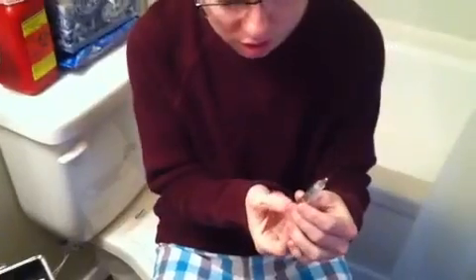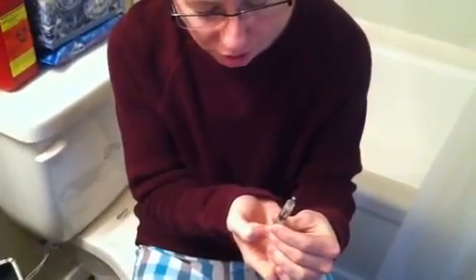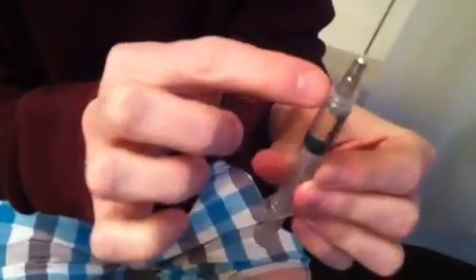So you snap it back on, twist it on, and you get that off. You want to make sure that it's on there securely. Push it all the way back up. Make sure you don't push the T out of it. Just push it enough so that there's not an air bubble in it. And you can kind of start seeing the T go up into the needle right up in here. That's usually when I stop. Okay, so you're going to find your spot again, the one that I told you not to forget where you put it.